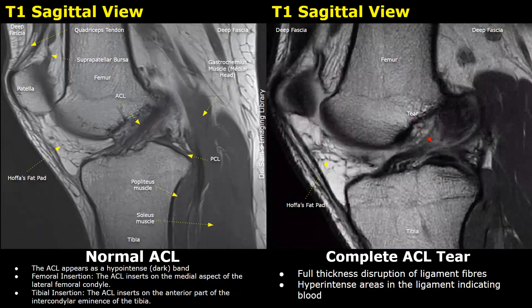This is another case of a complete ACL tear. We can see a full-thickness hyperintense area and a full-thickness disruption of the ligament fibers. The hyperintense areas inside the ligament indicate hemorrhage.